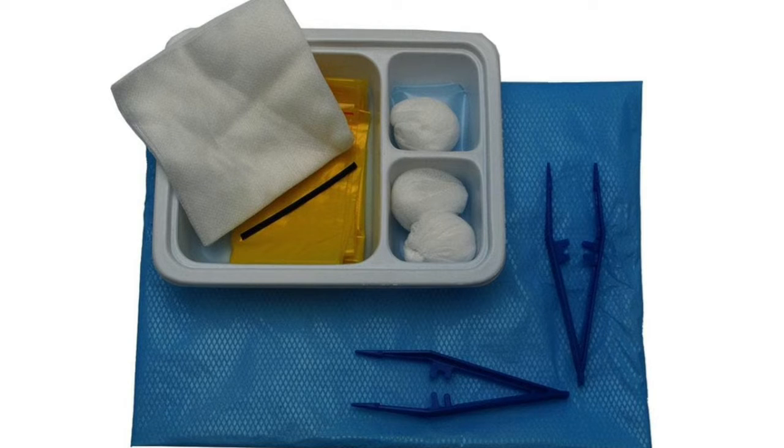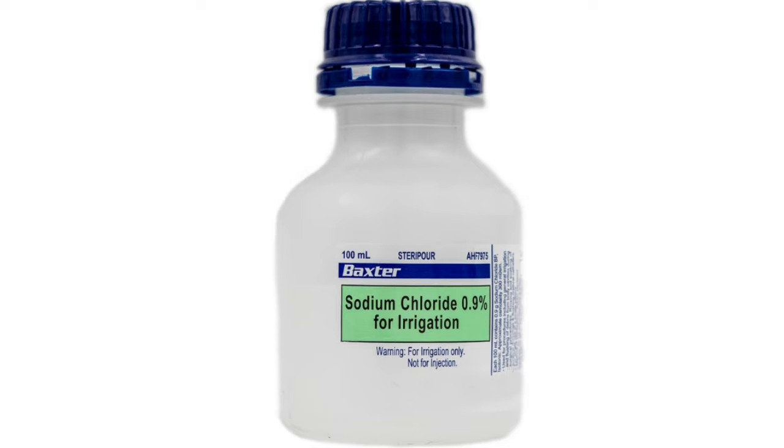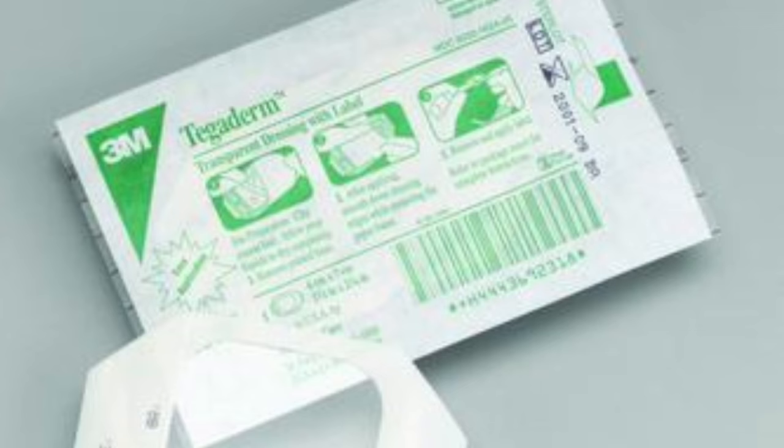Now for the equipment for a catheter dressing: small dressing pack, 2 keyhole gauze dressings, 0.9% sodium chloride for irrigation, and a transparent dressing. Now we're going to talk about how we want to start on a suprapubic catheter dressing. As we mentioned, a suprapubic catheter dressing is just another fancy name for a urostomy dressing.